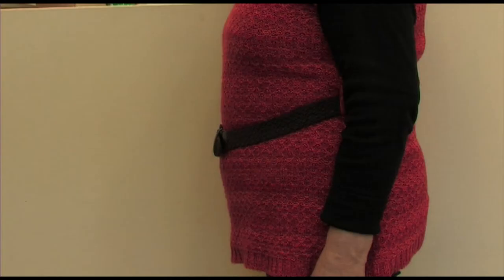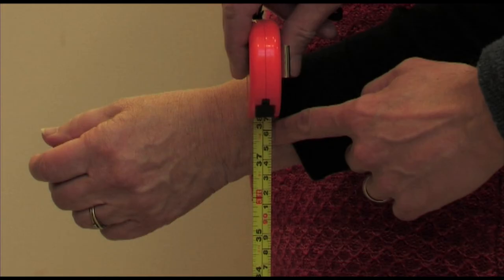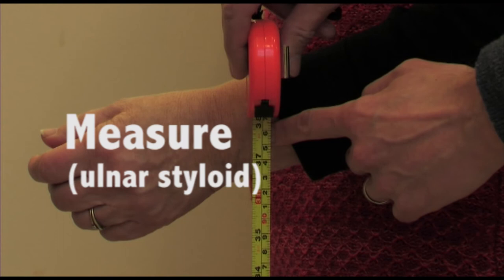Firstly, the walking stick needs to be at the correct height. Stand with your arm by your side and then bend your elbow to a 90-degree angle, then relax the elbow slightly. Measure from the wrist ulnar styloid to the floor, and take this measurement as the height of the hand grip.